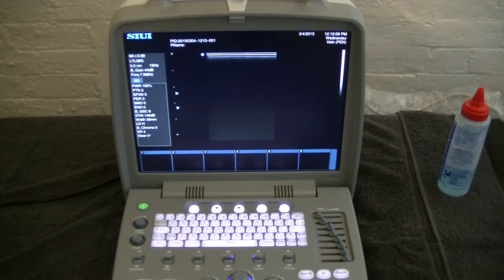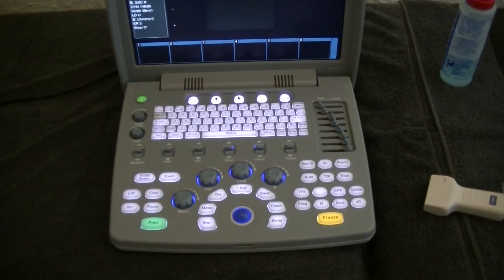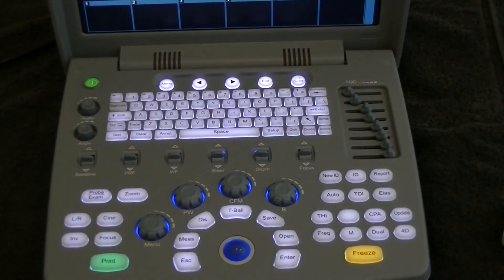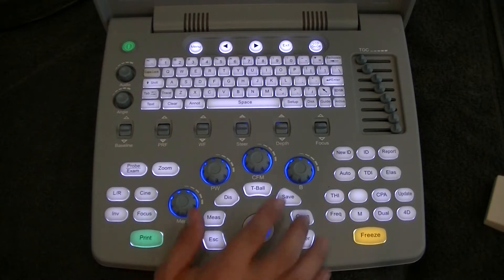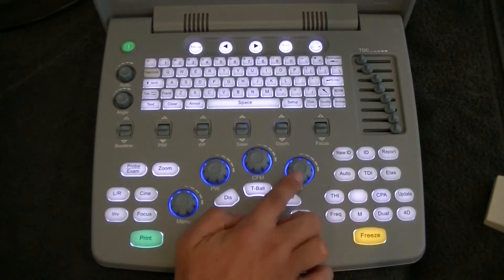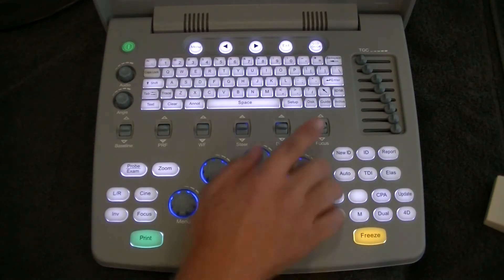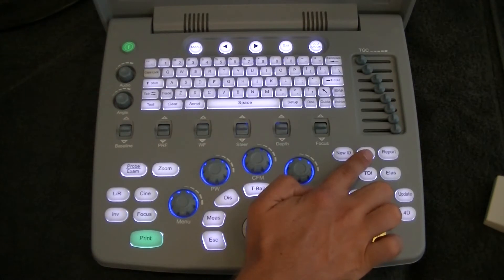Now that the unit's loaded up, let's have a look at the various knobs and buttons on the keyboard. Looking at the keypad, the main knobs we need to know are the depth, the focus, our gain in V mode, time gain compensation, and our ID for entering a new patient.